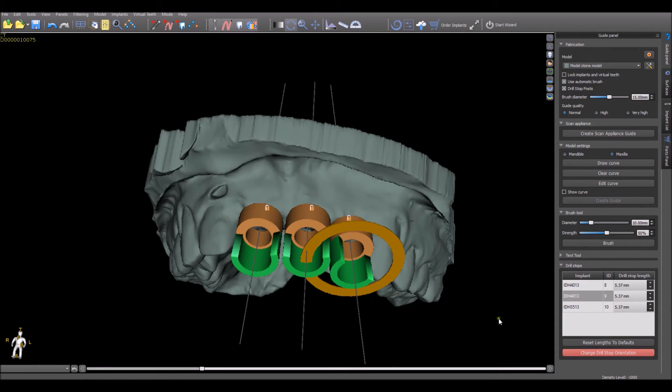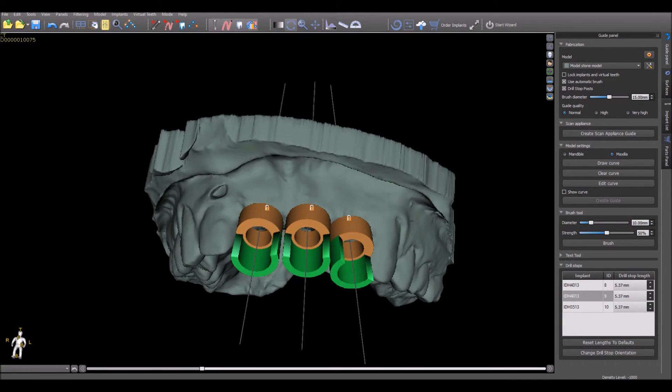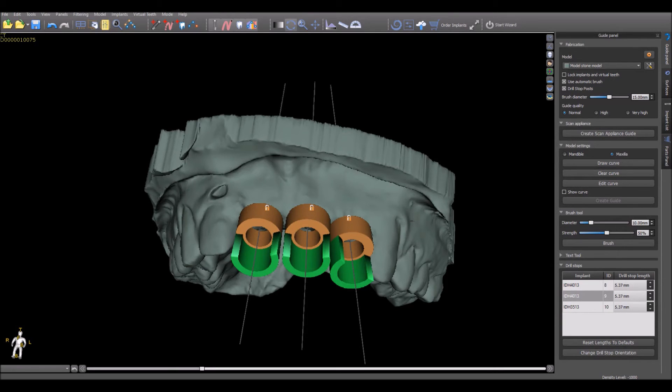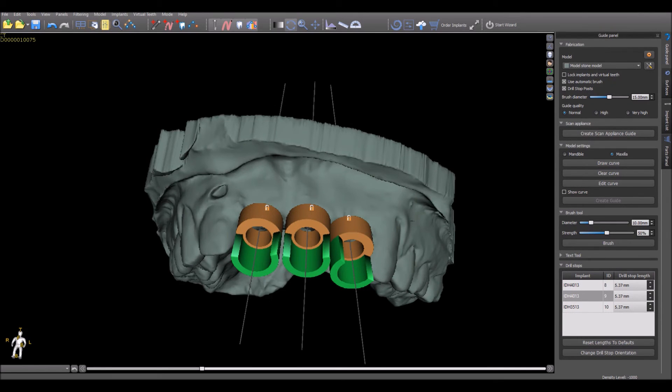Any changes made to the built-in drill stop length or orientation should be made prior to drawing the curve and fabricating the surgical guide. Once the surgical guide is fabricated, no changes made to the settings after the guide's fabrication will affect an already designed and fabricated surgical guide. The surgical guide can be deleted and a new one can be fabricated based on the new settings.